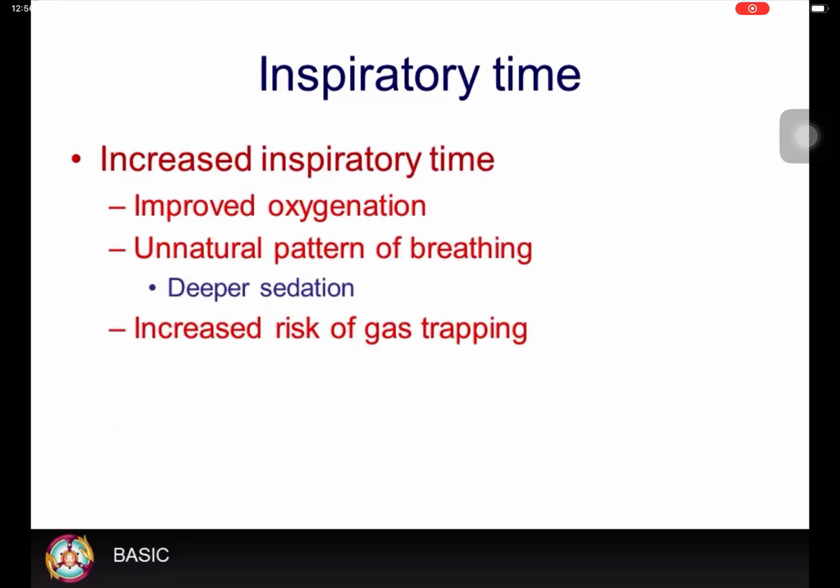Although increasing the inspiratory time may improve oxygenation, inspiratory times of more than 30% or IE ratios of more than 1 to 2 are often uncomfortable for the patient, resulting in a need for a deeper level of sedation. In addition, less time is available for expiration, resulting in an increased risk of gas trapping.